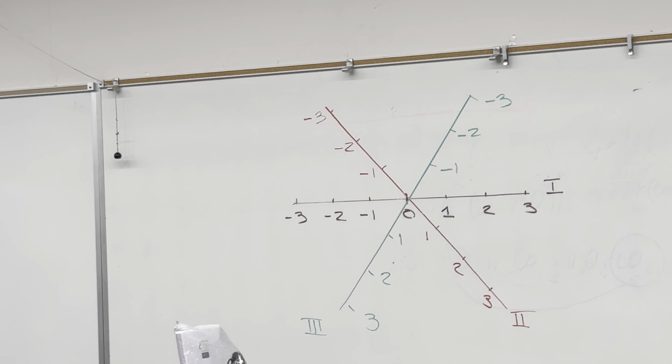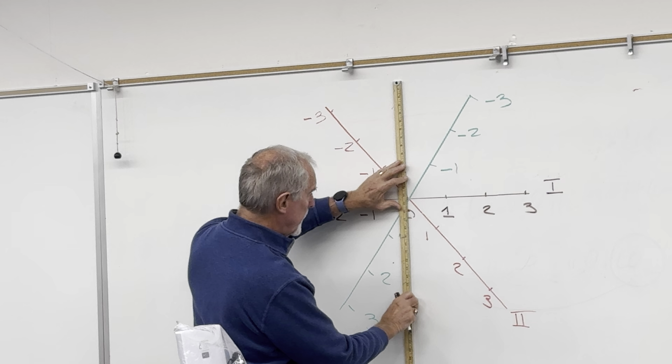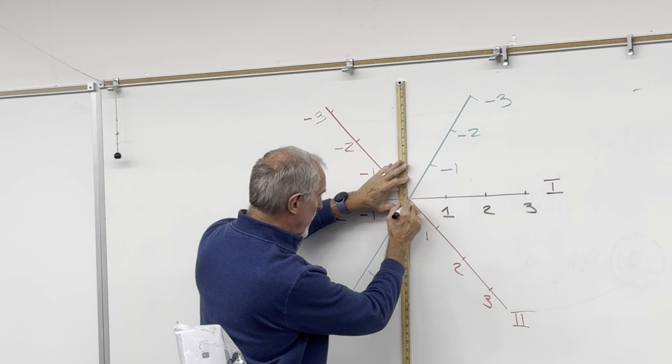Vector cardiography. Here's a vector. Here's the electrical activity of the heart.